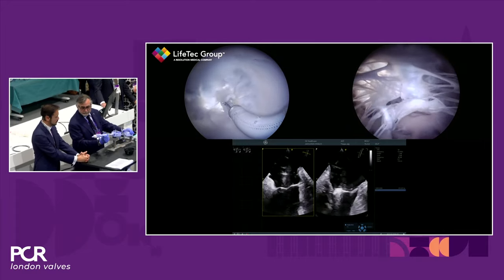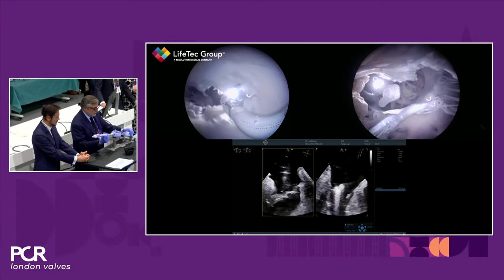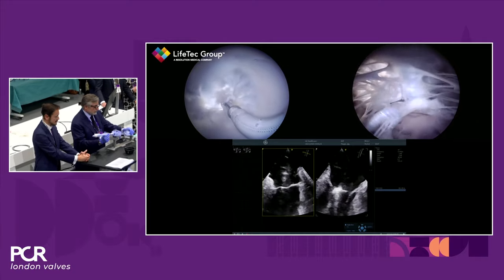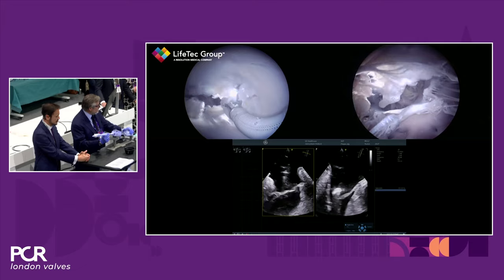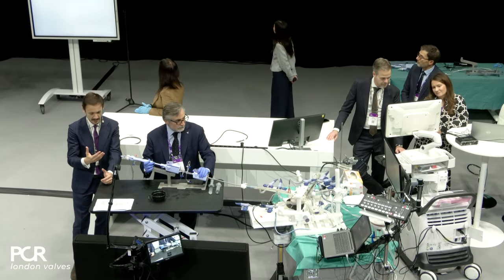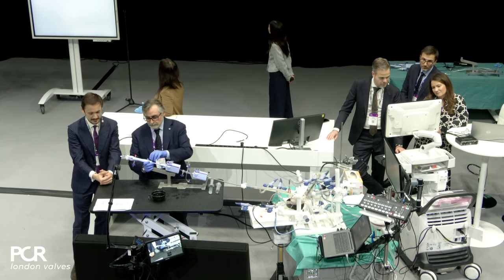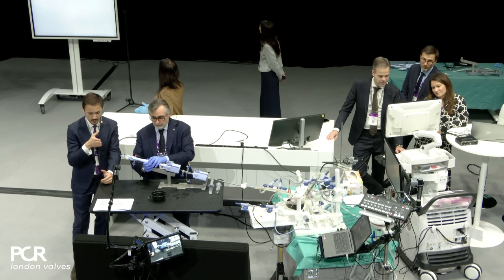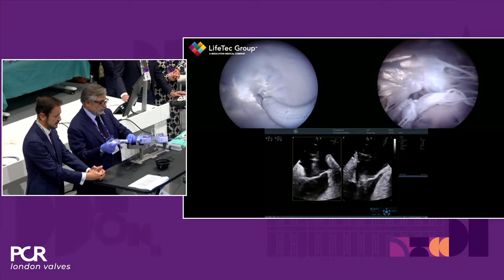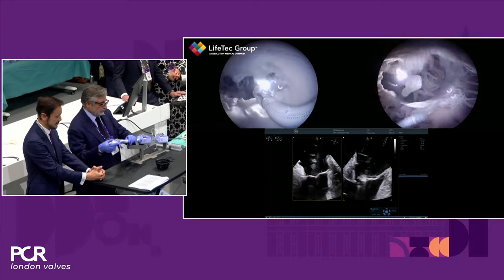So now Paolo put the clip exactly in the middle of the valve, so in the A2, P2 region. And obviously, the same principle that we mentioned before for the tricuspid are true also for the mitral. So symmetry is extremely important, and trajectory as well. So being coaxial is also depending on the transeptal puncture, obviously, in mitral. Here, the transeptal puncture has been already done, let's say. But if you have a proper transeptal puncture, you can approach the mitral valve with coaxial trajectory in most of the cases, and then you put yourself above your target zone, so again, A2, P2 in this case, and you can open the clip arm.